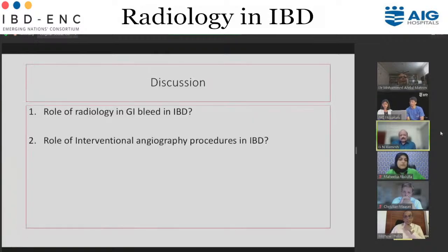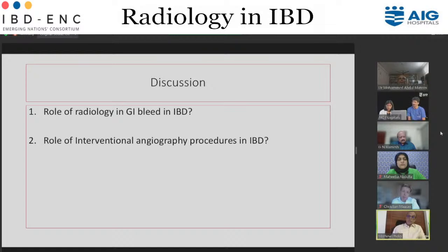Okay. Doctor, can I just ask one technical question here? Madam, suppose the bowel was filled very well. The polyp would have been seen by imaging? Bowel filled with feces, sir? No. What I mean is when you do an MR angiography or MR enterography, if you actually fill the bowel with liquid, what we do for an enterography, do you think it means the chances are the small polyps like this get flattened out against the bowel wall? So we may not pick them up when we overdistend the bowel unless they are large enough. And the spatial resolution of MR is definitely not up to the mark to be able to pick up these tiny polyps.